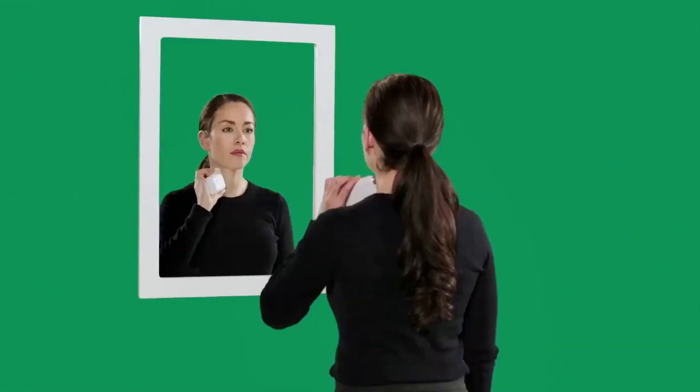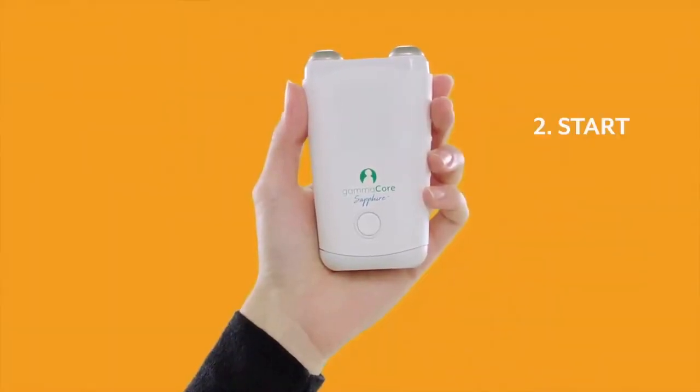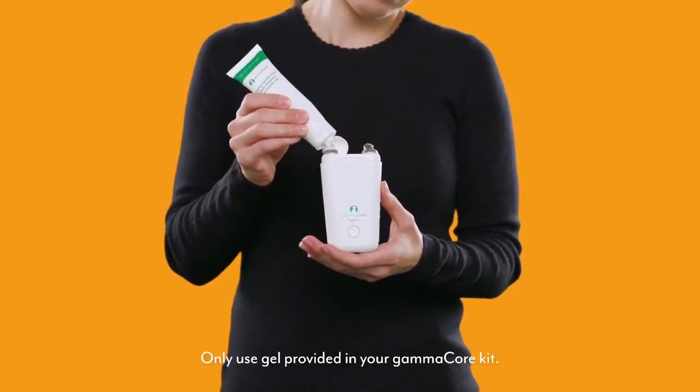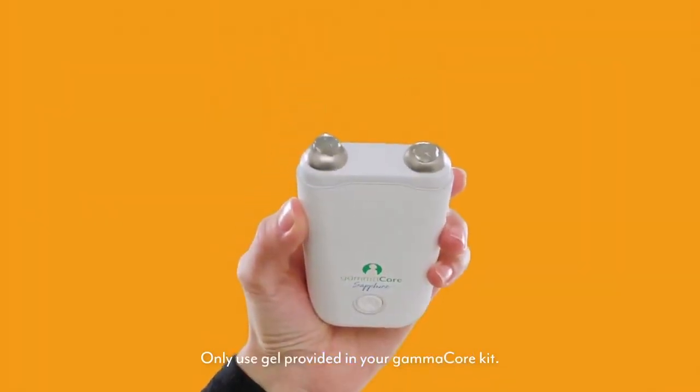Practice positioning GammaCore in front of a mirror a few times before you turn it on. Once you ensure your device is loaded and you've practiced placing and positioning the device, you are ready to start. First, apply a pea-sized amount of the provided conductive gel to each stimulation surface. Be sure that you use only the gel that was provided in your GammaCore kit. Do not use other gels.